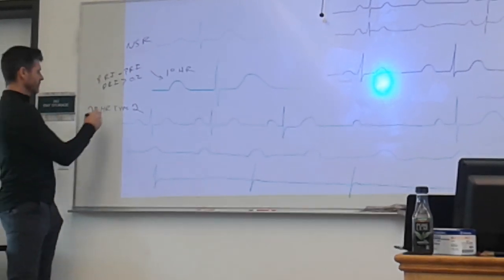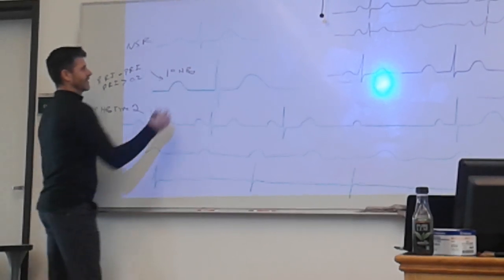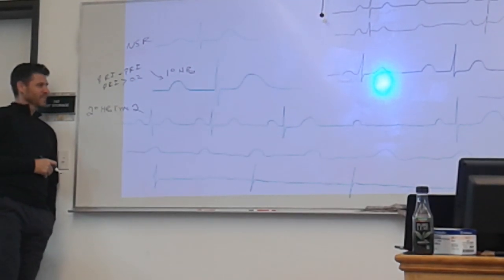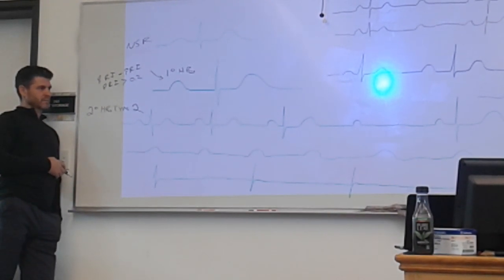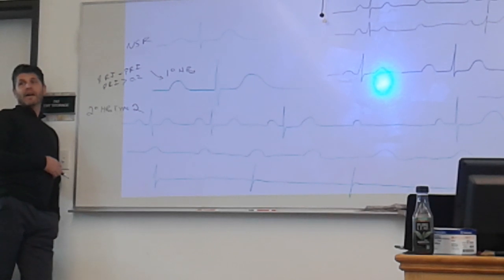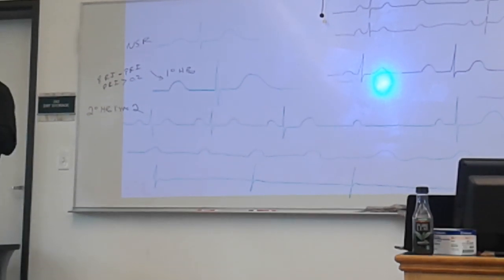What's that? The top one, first degree block. Heart block. So then I have a second degree heart block, type 2. Is the PR interval still within normal limits usually? It depends. It's possible that I have a second. So the first degree heart block is crap.